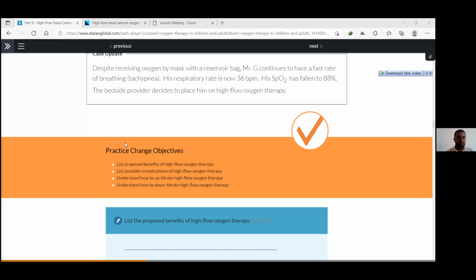I think one participant also said it avoids complications of intubation like aspiration and so on, but I don't think so, because we have patients who can be at risk of aspiration when they are on high flow nasal cannula. So you need to individualize it from patient to patient. Patients who clearly have risk for aspiration, we have to protect the airways with intubation. And for the question on dead space versus PEEP, I think most of you have said it very nicely. I will reveal the answer.